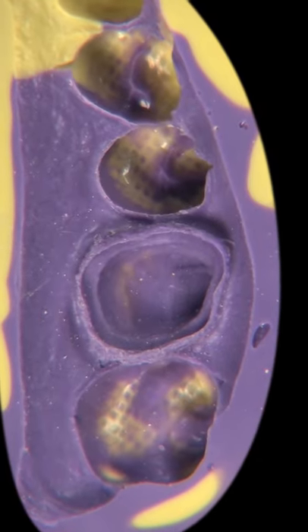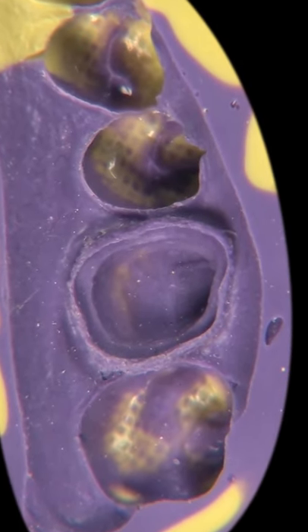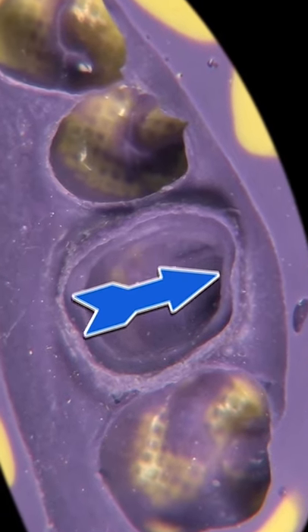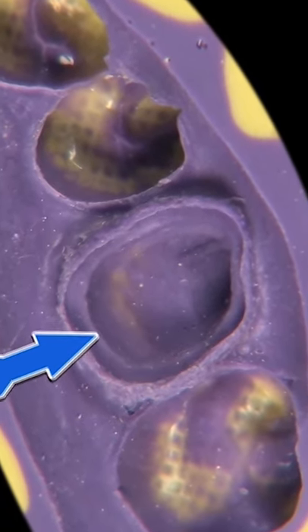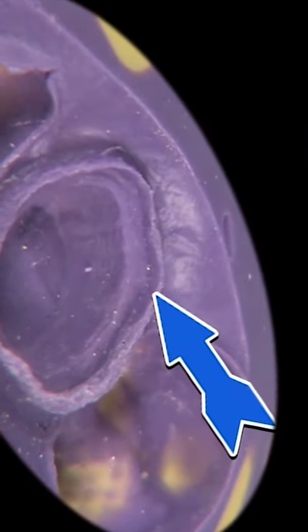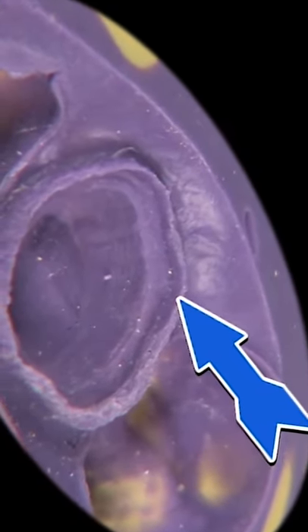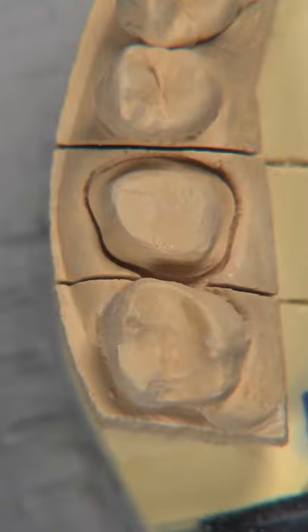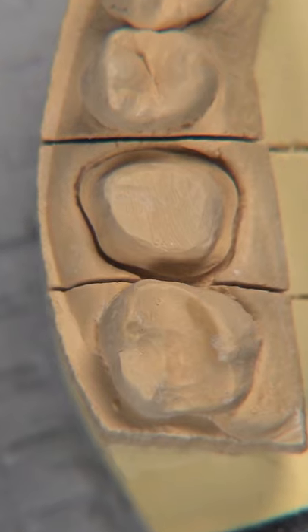Let's take a look at the actual impression of the prep itself — it's gorgeous. It just does not get any better than that. We can clearly see the margin defined 360 degrees around the tooth itself. We can see a tag of material, at least a half millimeter of material beyond the margin, so there's going to be no doubt in the technician's mind.